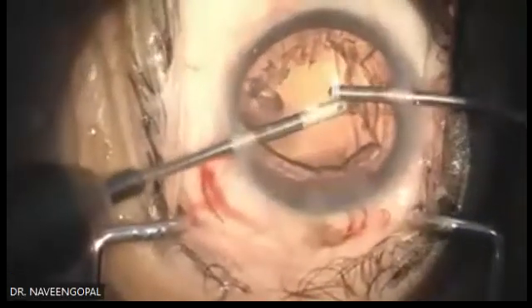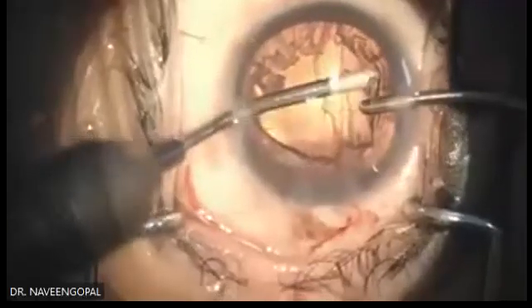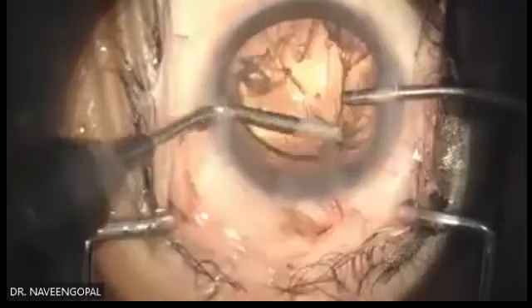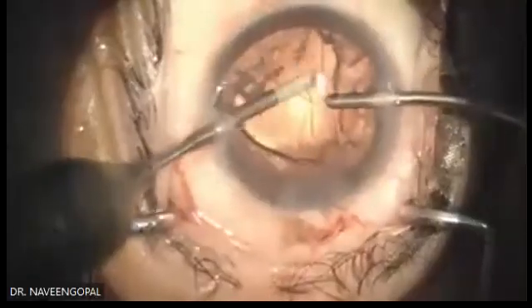Load the lens, take the D cartridge. Usually my assistant, Muniraj, has been assisting me for the past, say, 8 years now. He is very good in assisting. So half my headache is over there.